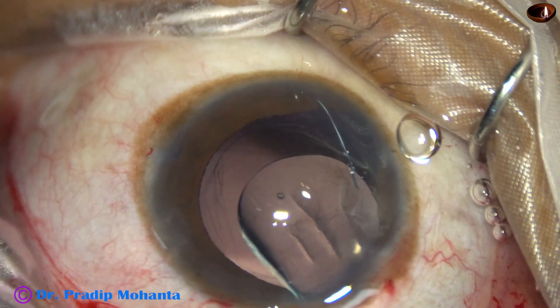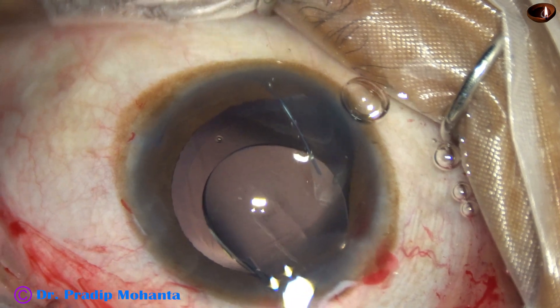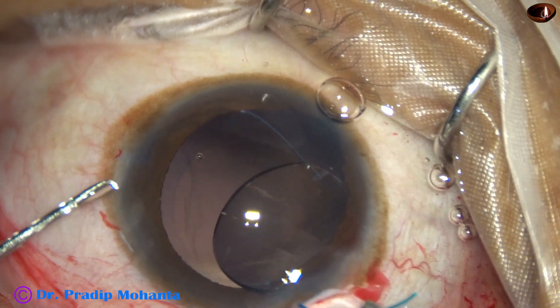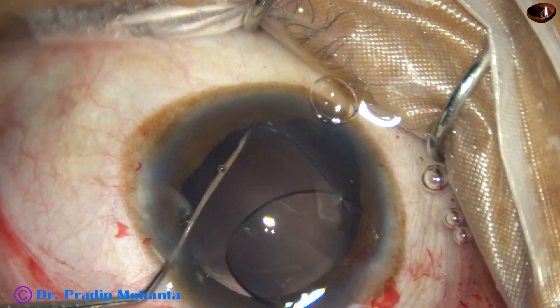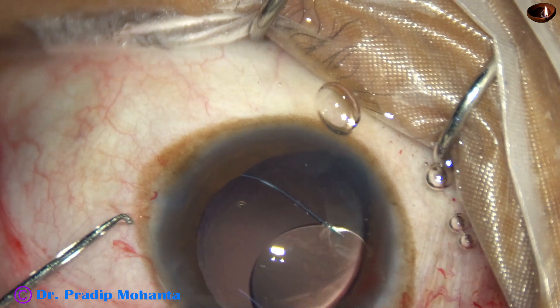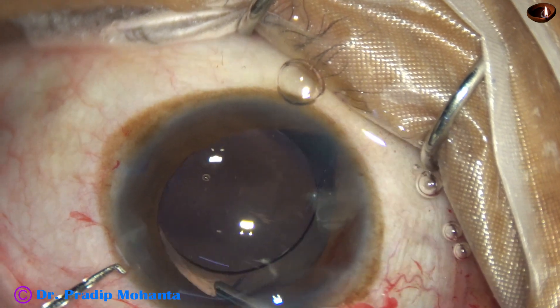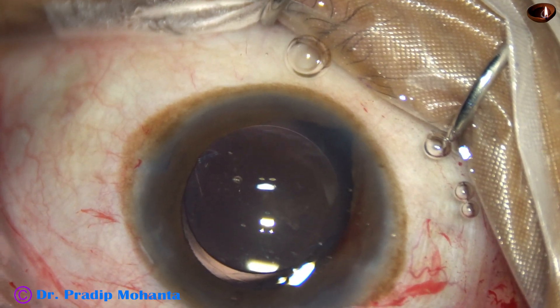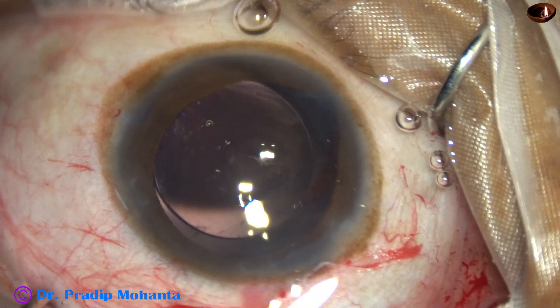Here goes the lens. The leading haptic is placed over the iris — never try to place it directly in the sulcus at this point, because if you do that suddenly the haptic may go into the vitreous cavity and the anterior hyaloid membrane is gone. Now the leading haptic is placed in the sulcus, and then the trailing haptic is held with McPherson's forceps and it is placed in the sulcus. Both haptics are in the sulcus, but I have some doubt whether the leading haptic is truly in the sulcus.